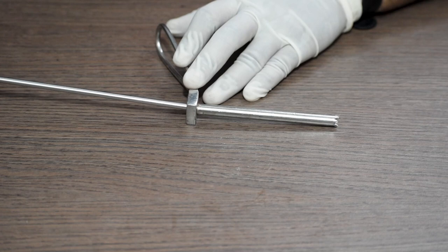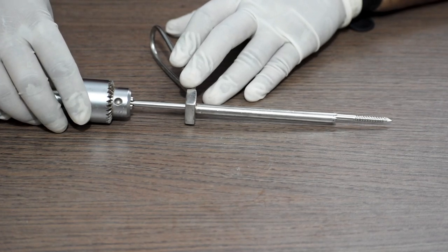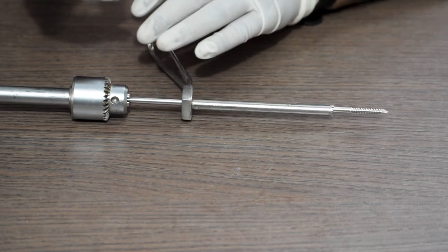Thereafter, we will take the Schanz pin and insert it through the protection sleeve with the help of the tip of the T-handle chuck with the key attachment.